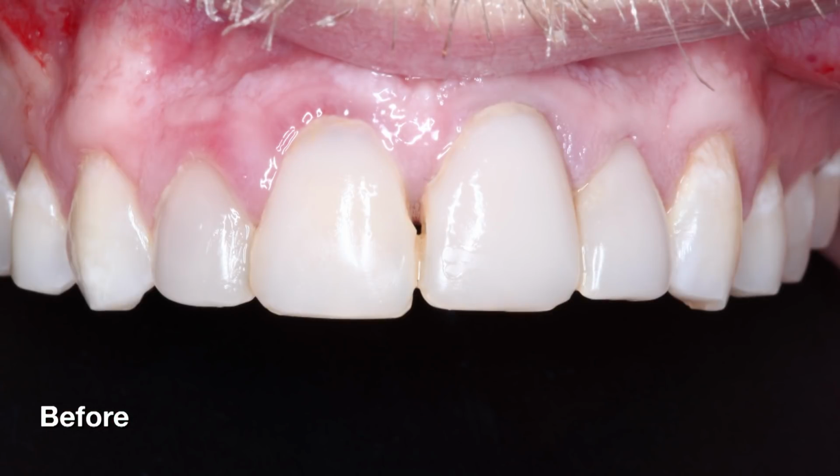Some of the composite is discoloring and breaking down between the centrals, and also overhangs with the restorations along the margins are causing gingival inflammation, especially around numbers 7 and 8. The plan for the patient is to replace the old composites with Obsidian lithium silicate veneers.